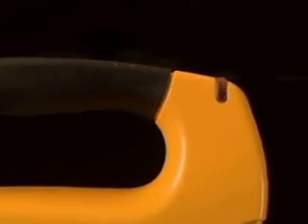The active status indicator, also known as the ASI, is located in the upper right corner of the AED and flashes periodically to indicate the status of the lifeline. A flashing green ASI indicates the lifeline is ready to perform a rescue. A flashing red ASI, or no ASI at all, indicates that the device may not be ready to perform a rescue and may need additional attention.